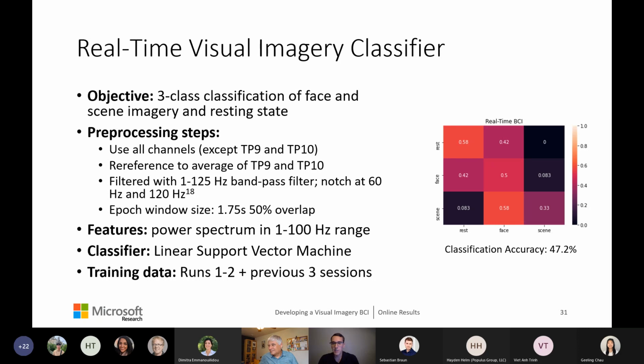So yeah, carrying out this experiment at home, like if we were trying to ship people equipment, I think that would be kind of difficult. Sharing equipment around, the EEG caps are relatively inexpensive, but they're still not super cheap to send around to people. And it would be hard to rely on people having equipment like that at home. So working from home is definitely a challenge with experiments like these that do require specialized equipment. It kind of requires a bit of lab space to do this in.